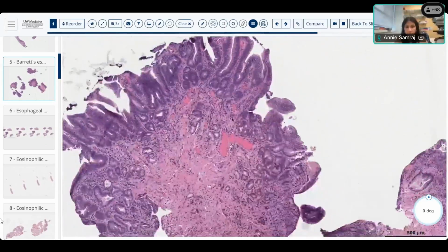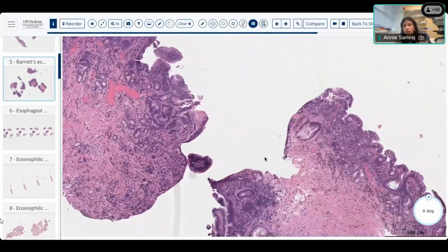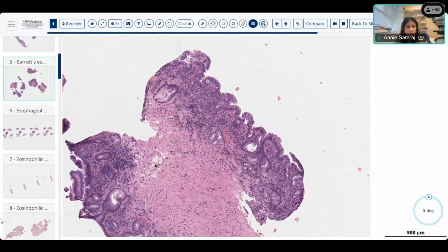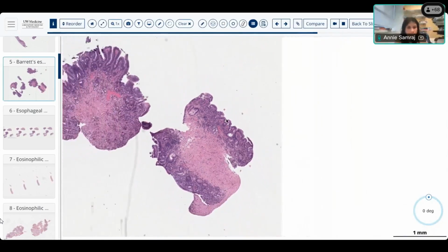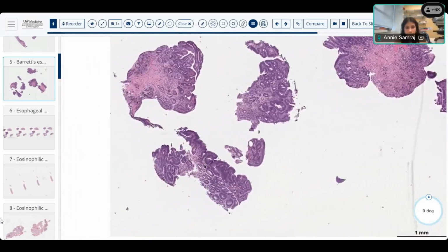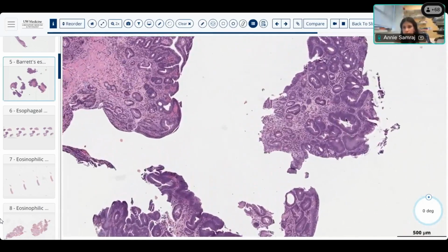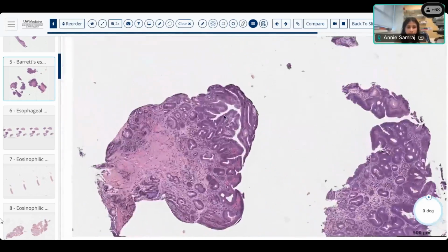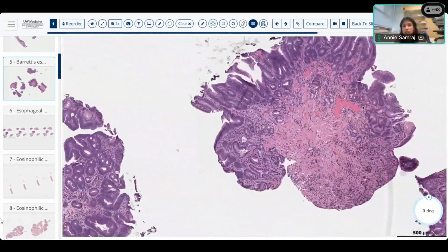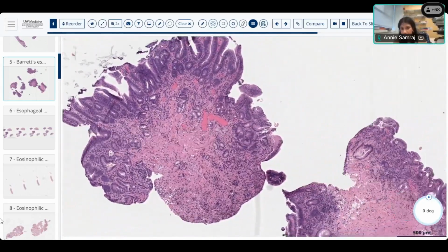On the other hand, when you have infection or a reactive condition, even though there are some changes, I'm trying to find some inflamed areas here. Let's see. All of this is dysplastic. But basically, when you have a reactive condition, the lines are still somewhat maintained.